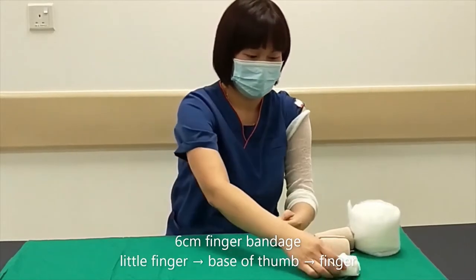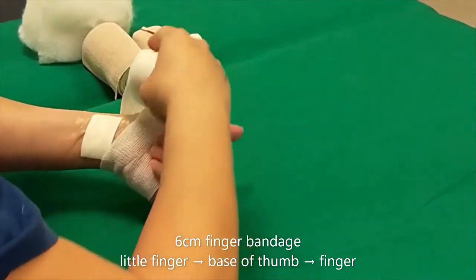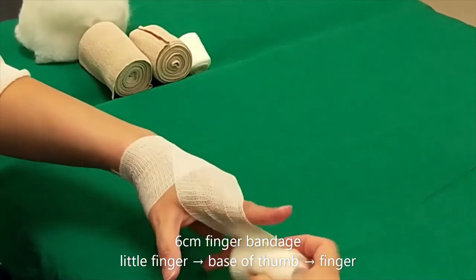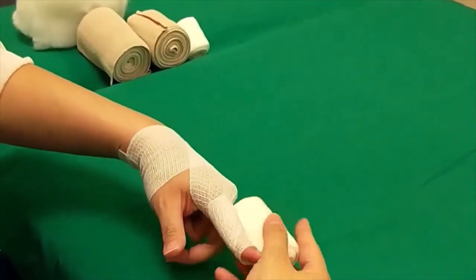Take a 6cm finger bandage and secure it. Start on the little finger side and go over to the base of the thumb. Wrap each finger 3 or 4 times until you cannot see the skin underneath.